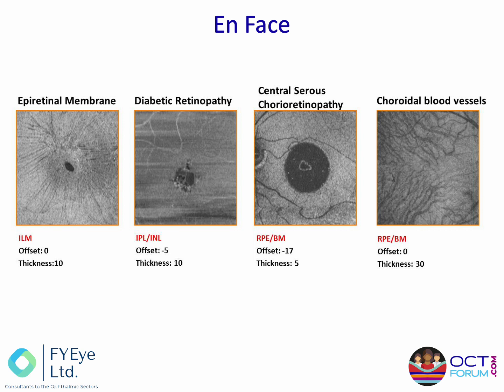On the RPE-Bruch's image, we have a dome-shaped central lesion filled with fluid, which is CSR. And into the choroid, this is a normal view. But looking at the choroid on en-face is very, very helpful to spot nevi, for example, which will appear white or in negative, or things like choroidal neovascular membranes, for example.